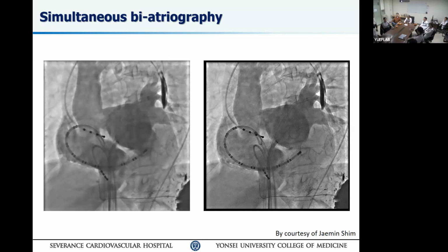Don't do that. Be gentle with the fossa, gently. When you tent it, even if you push hard, the needle tip is what, 10 millimeters? You've got plenty of space, unless you're tenting all the way to the lateral wall.